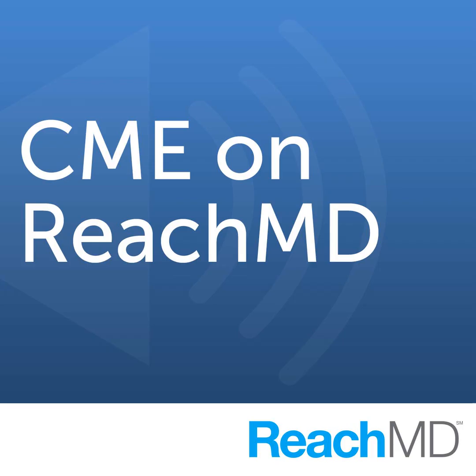It's not necessarily there at rest. We need to look for it at the time of echocardiography using provocation maneuvers, classically the Valsalva maneuver, an easy thing to do at the time of your echocardiogram, but also potentially with exercise and standing. And we should be looking for it. You have to be proactive in your echo department looking for outflow tract obstruction.